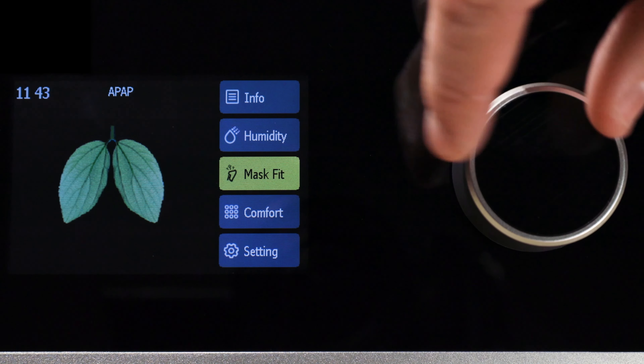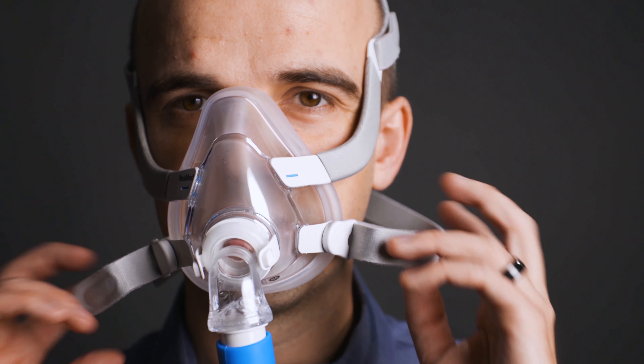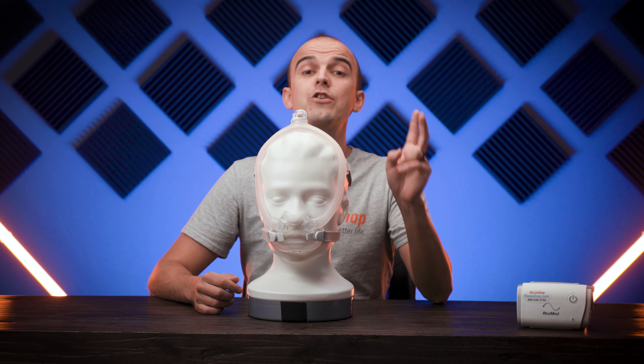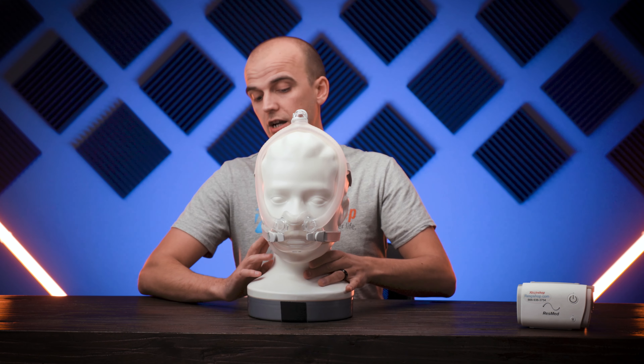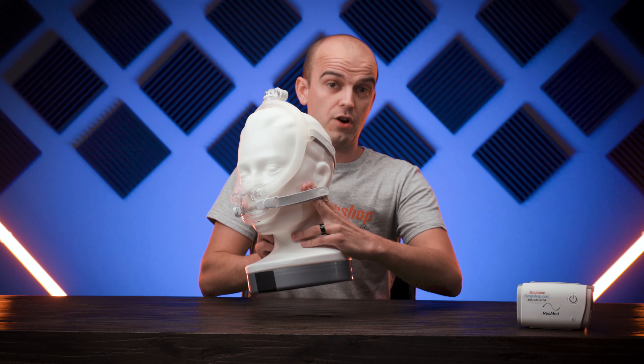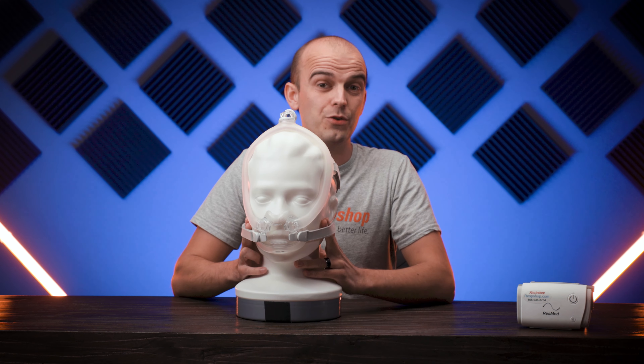To check the fit of your mask, test it at therapy pressure levels, perhaps using a mask leak test if your device supports one. If your device doesn't have a built-in mask leak test, the manual way is to take the palm of your index finger and middle finger on both hands and touch the skin under the straps on either side. You should be able to fit both fingers under the strap — if you can't, the seal is too tight, and if you can fit more than two fingers, it's too loose. Make sure you're not testing at the starting ramp pressure, as the seal may be sufficient at the lower pressure but could fail when pressure increases to its maximum therapy level.